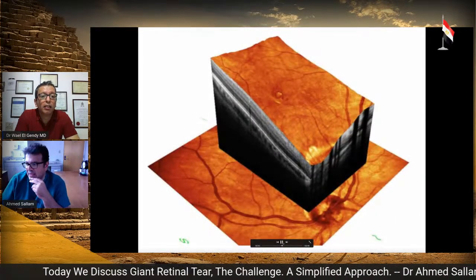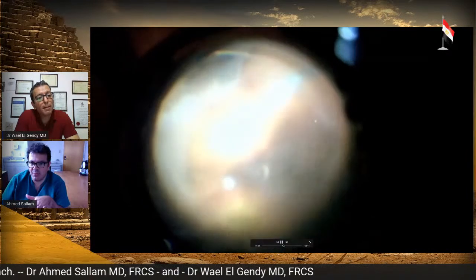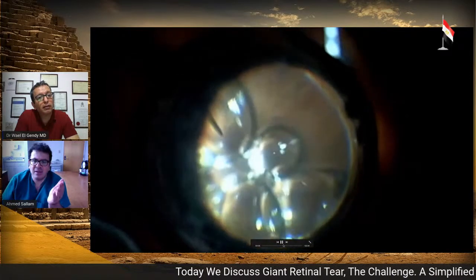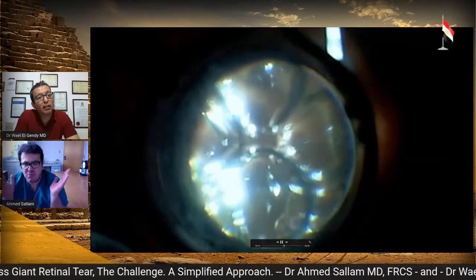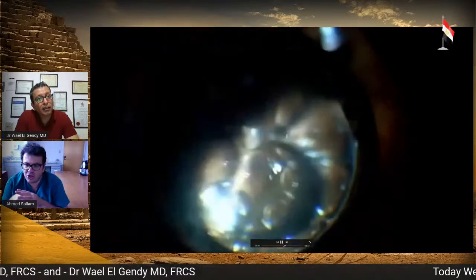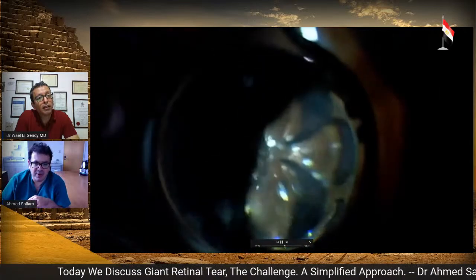And one of the reasons that they can happen, speaking about PFCL, this is a patient here with a very highly mobile retina to start with. So I use PFCL to support the posterior retina. And now I'm trying to find the tear and indent. And what happened is sloshing, because you're indenting and then removing the indent quickly. The PFCL surface tension breaks and you get sloshing of the PFCL, which is itself not a problem. You can just touch it, but the problem is the bubbles can go under the retina.